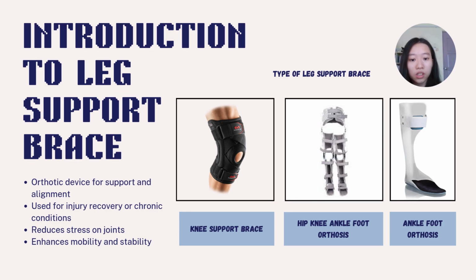So there are three types of leg support brace currently in the market. First of all is knee support brace, and then hip, knee, ankle, foot orthotics, and ankle, foot orthotics. So next I will explain what is walking and the theory behind it.